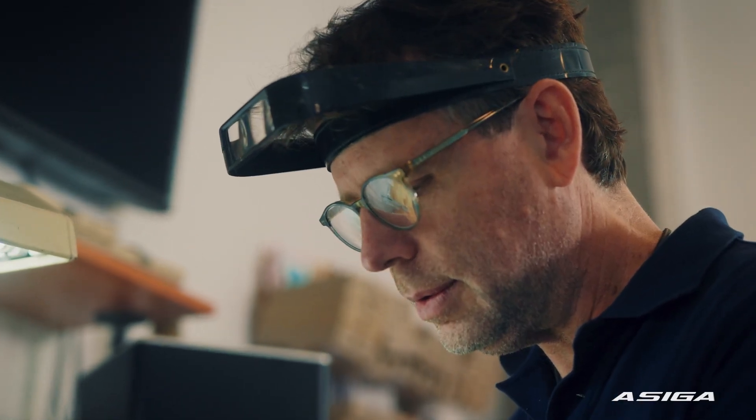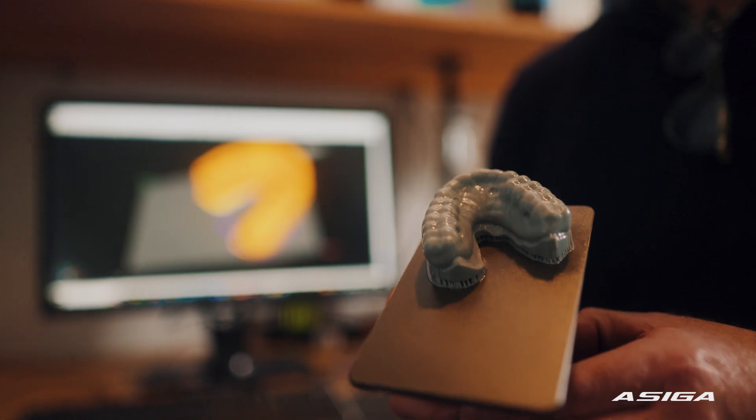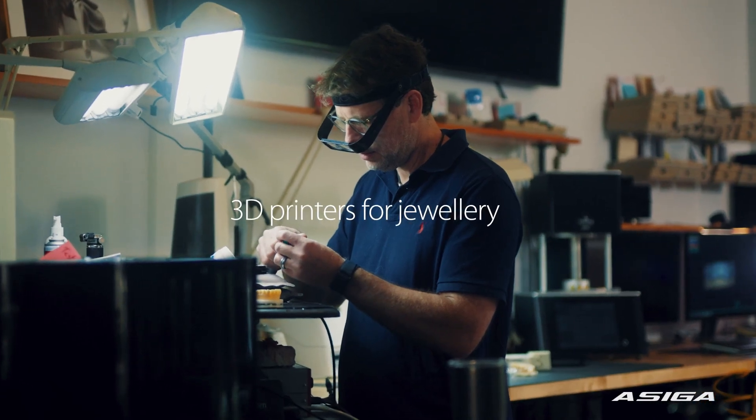The lab was just living month to month paying bills, and going digital with printers — that's the first time we could actually have a little bit of savings. Doing it the analog way you were just guessing. There's no more guessing — it's all so precise. That's the most important thing: people who haven't gone digital are depriving the patient of better work and a better outcome.